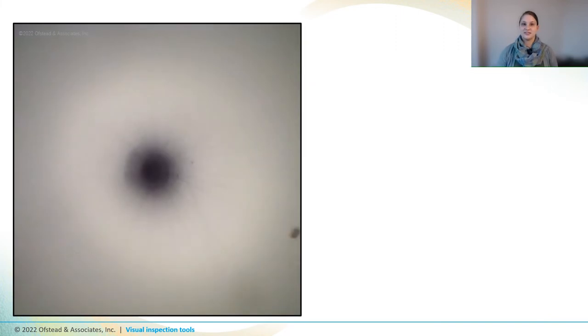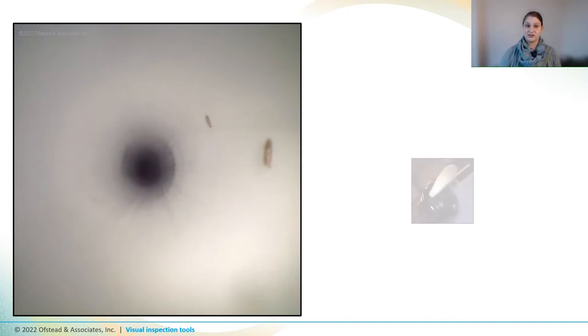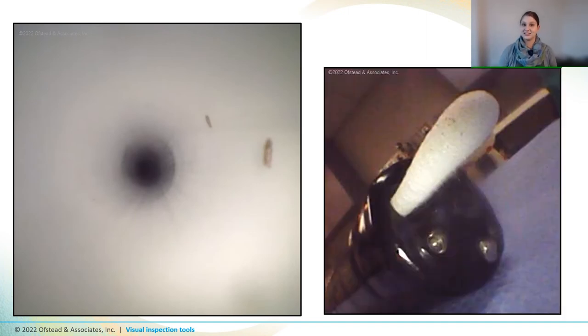This video shows the kind of residue and debris our boroscopes have encountered inside fully processed endoscopes. There are clumps of brown stuff all over the channel, and when we passed a swab through the channel, it came out with lots of dark particles embedded in it. That means your boroscope might get exposed to soil, germs, or anything else that's inside your scope.